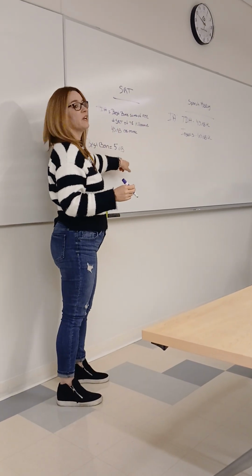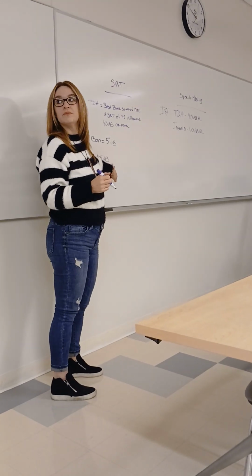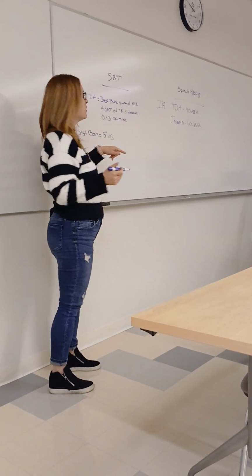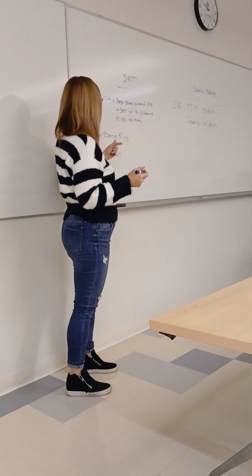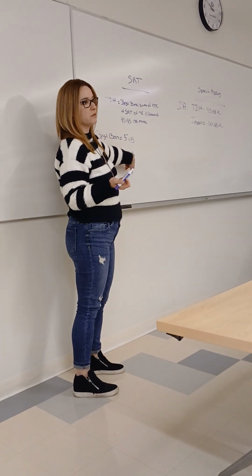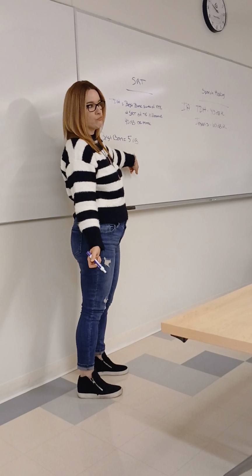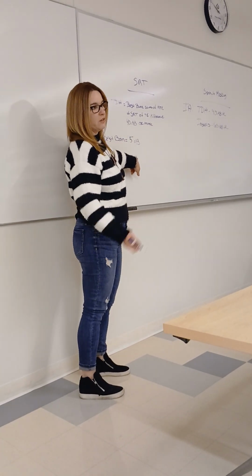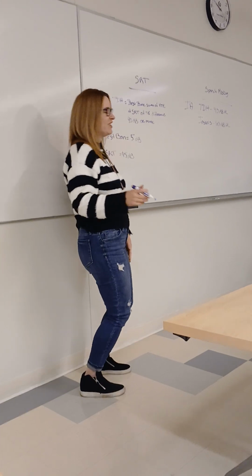Would we need, we're using headphones, would we need to mask? Yes. If we were using inserts, would we need to mask? No. Because our difference here is 40. For inserts, it's 60. So again, another reason to use inserts.